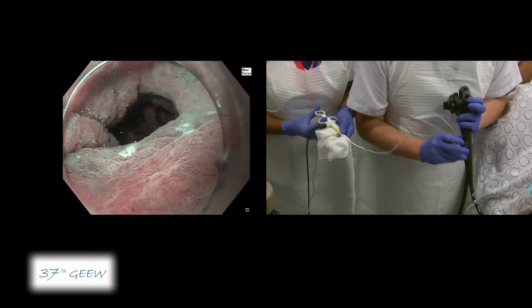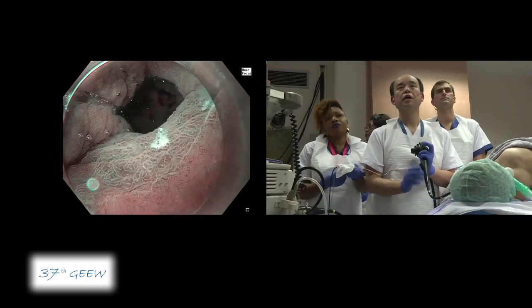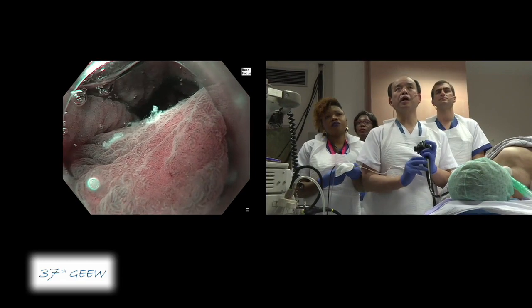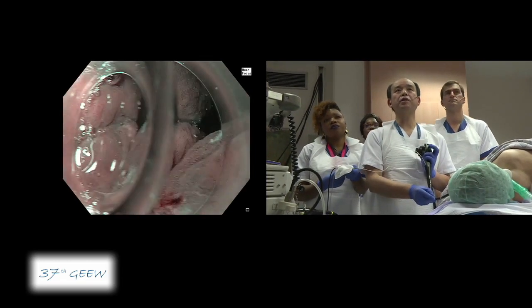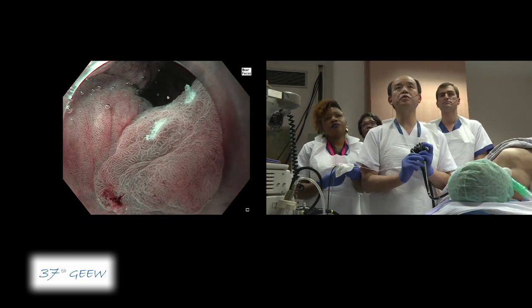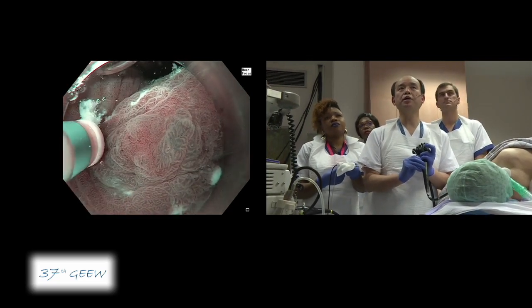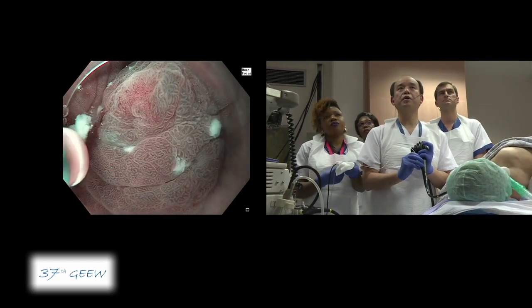Professor Yagi, what kind of settings do you use for marking the lesion? This is the Olympus ESG-300, and currently I am using soft coagulation, effect 3, 80 watts. This is very good for marking.